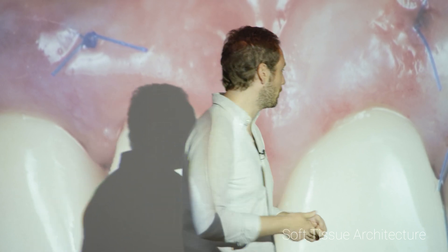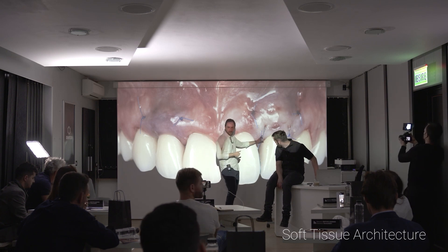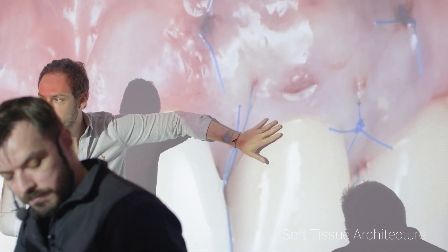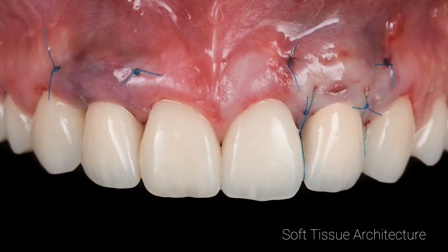If you put tension you start to lose tissue — you can create scars because of the tension, you lose vascularity, and sometimes you create necrosis. So the first step, the punch technique, is the most important. Placing the graft and creating mobility — everything is okay. Now it's just a simple 6-0 suture to bring the tissue down.